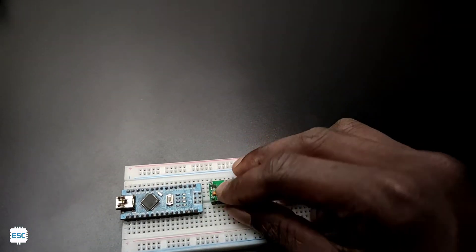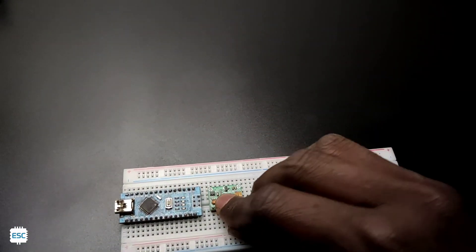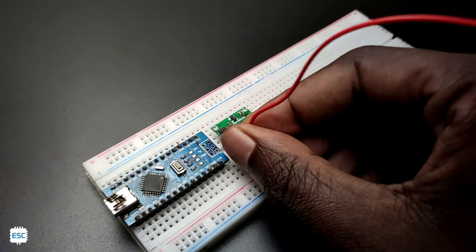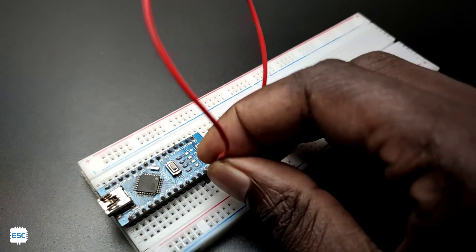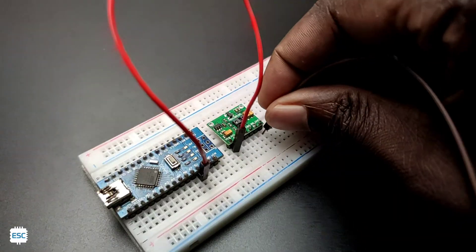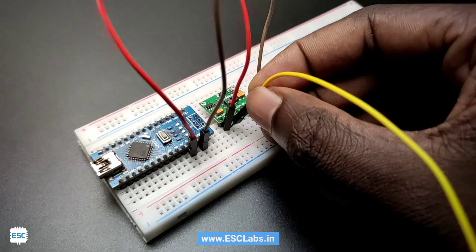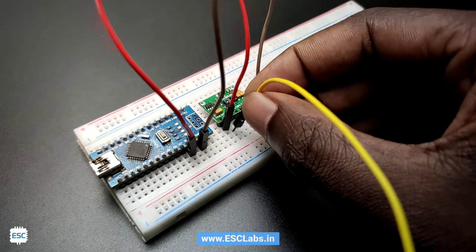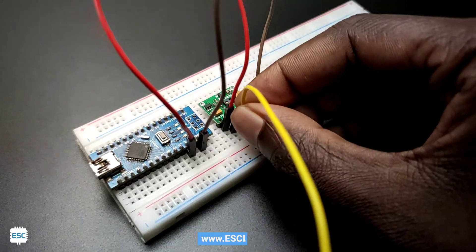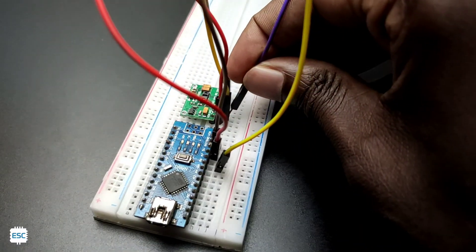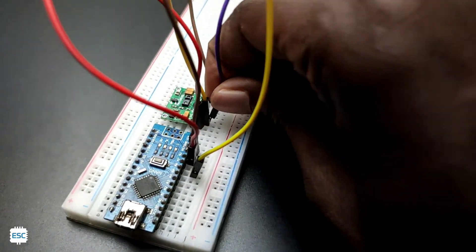Then I placed the pulse oximeter module and connected VCC to 5V of Arduino and ground to ground. Since the module uses I2C communication, I connected SDA to A4 and SCL to A5.